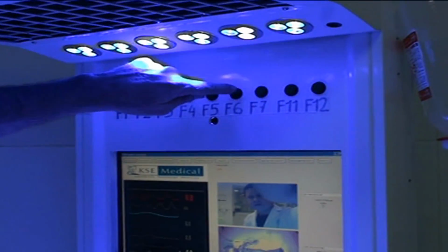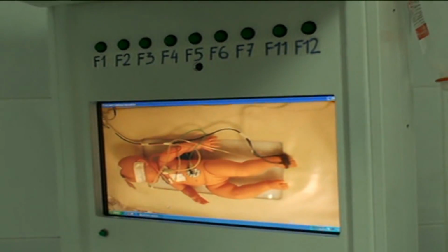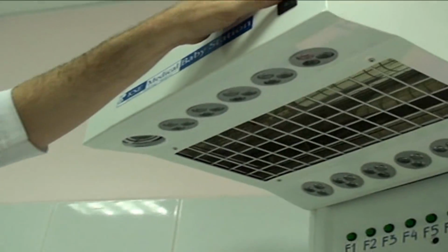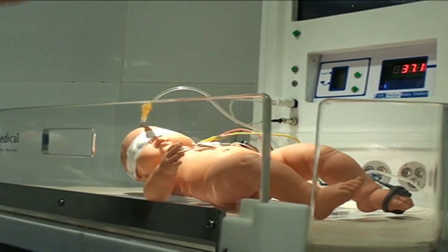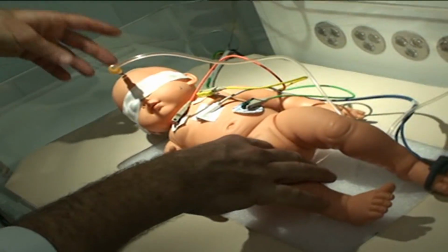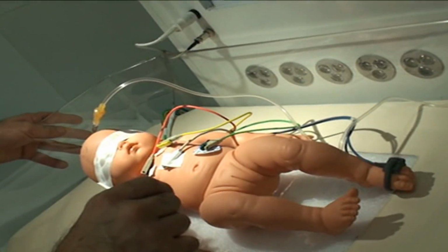Whenever they need to see the baby, this is the cam for the baby. Let me turn off my phototherapy so it's not so bright. And so the doctor and a remote senior doctor from any hospital in the world can give guidance on how to care for this baby that he's watching right now. They can look for retractions, color tones, any other grunting, any other symptoms that are hard to communicate verbally or in text, and they can see them. And then they can tell that doctor what to do and how to care and guide them to procedures.